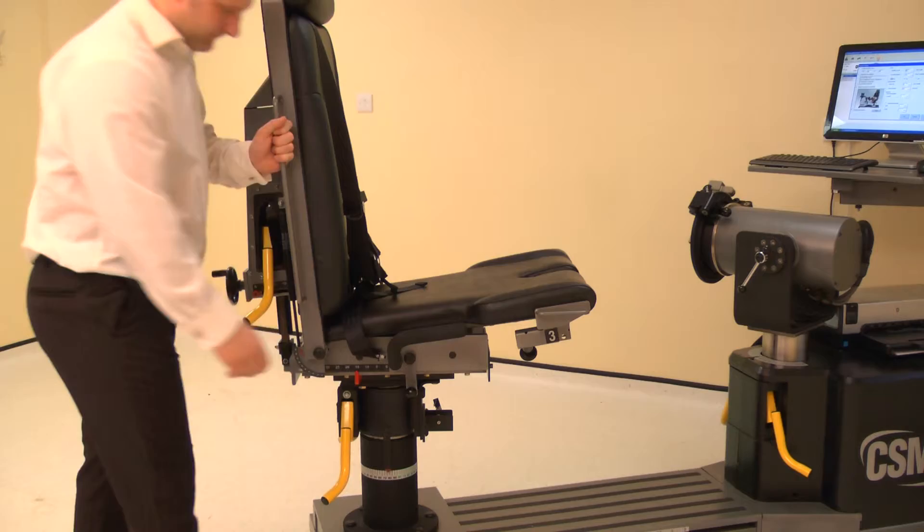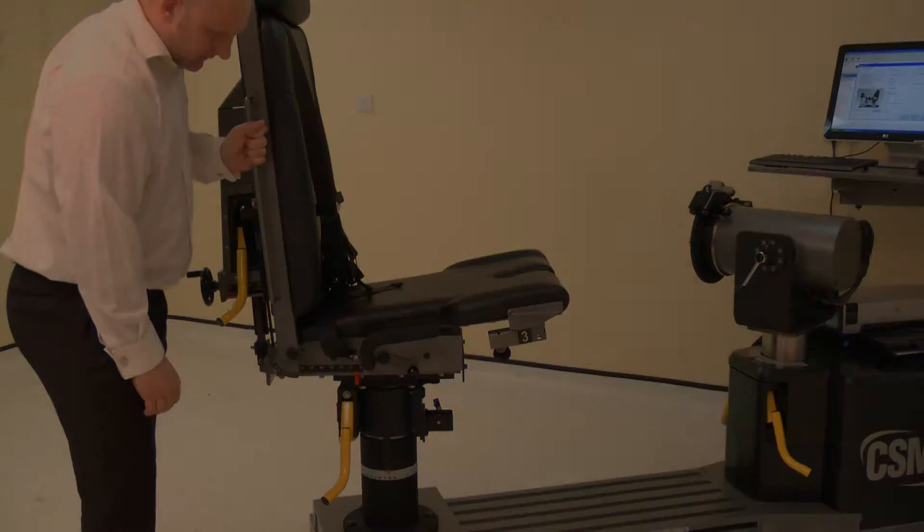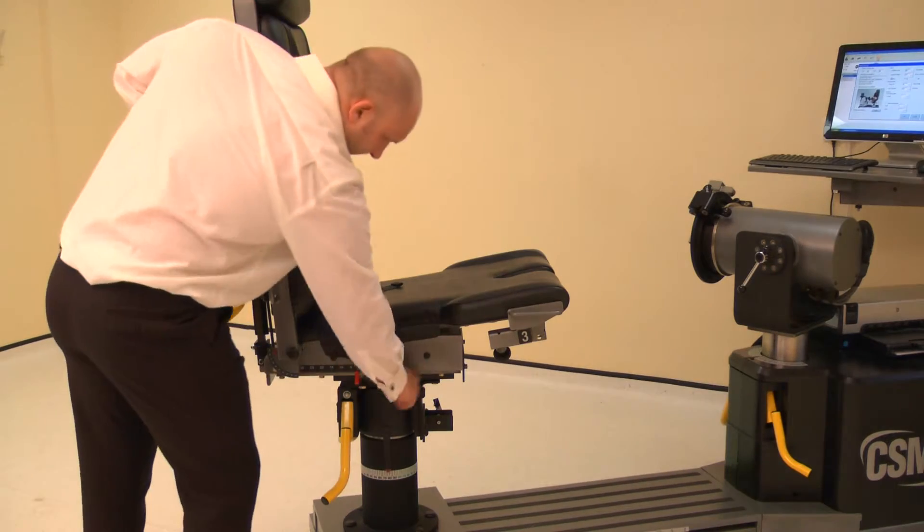The chair foreaft is altered by raising either locking handle, then sliding the chair bottom forwards or backwards. Adjust the chair foreaft to position 25. Lower the locking handle to secure.